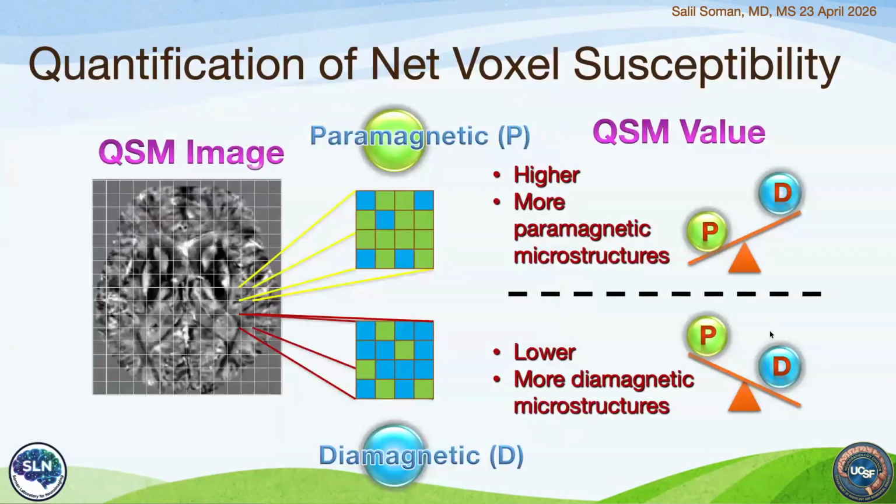One thing about quantitative susceptibility mapping, though, is that at every voxel, there is going to be some net paramagnetic and diamagnetic signal, because you're constrained by how you pick a spatial resolution. Whatever you pick, it's going to be a net value in each box. This is going to come up later, but just because it's quantitative, it doesn't mean that it's definitely calcium or definitely iron. It's more that there's a mix, and then we're trying to figure out clinically what's going on.